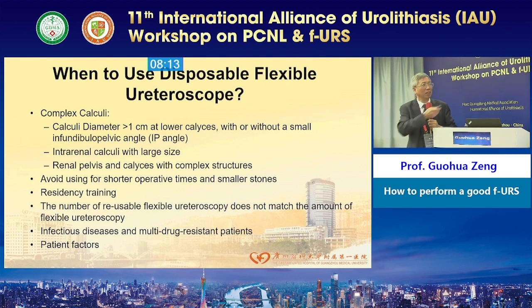It's not too good. Sometimes for complex stones, and for short operations and small stones you cannot use it. And you can use it for resident training. You can use sometimes for your hospital.